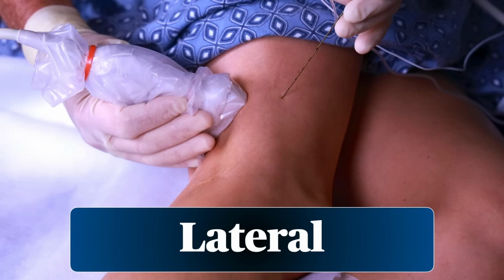The popliteal sciatic block can be performed in several positions. We prefer lateral as it offers nice ergonomics. The probe is placed on the popliteal crease and slid proximally until you're happy with the image. The needle is then advanced in plane from the lateral aspect.